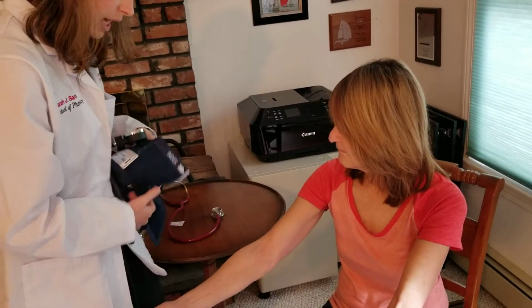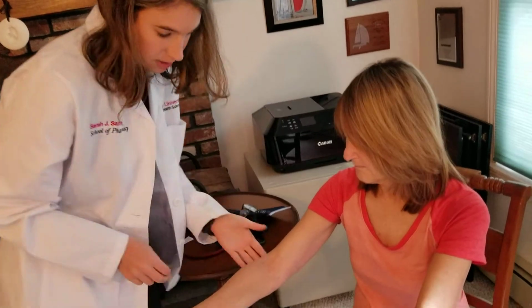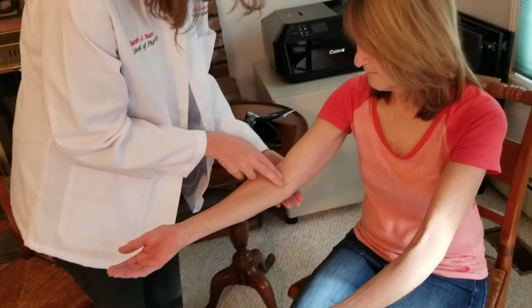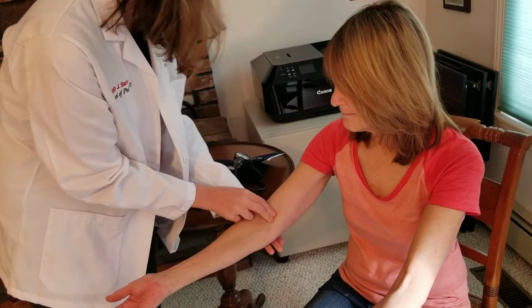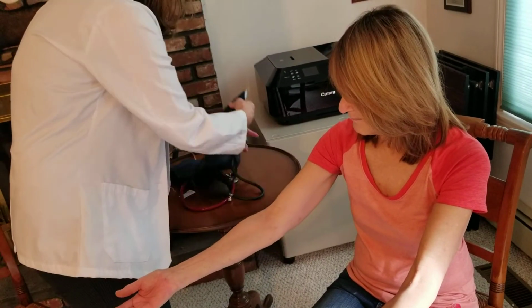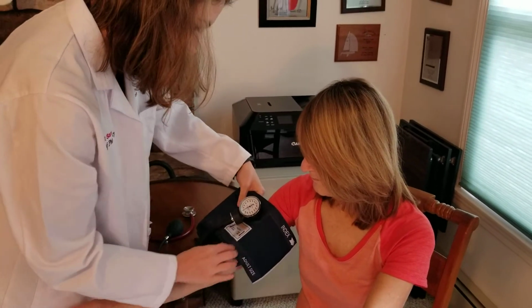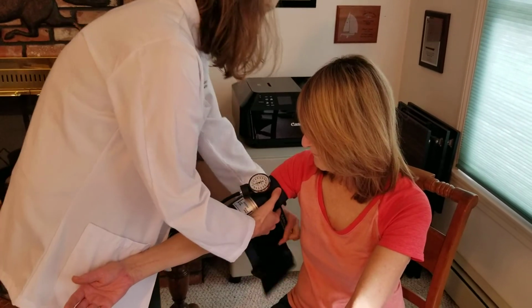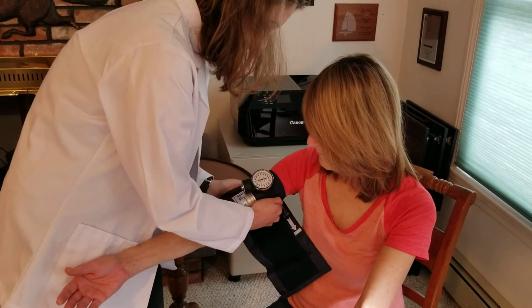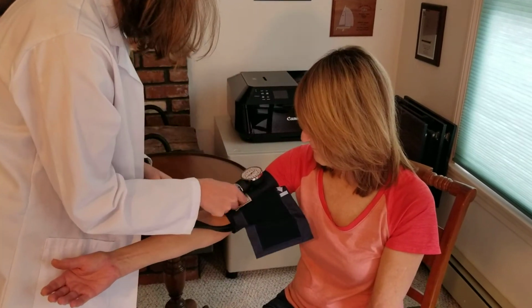So the first thing that I'm going to do here is I'm going to find your brachial pulse. So that's going to be here. Just over here. That's right there. So then I'm going to put the blood pressure cuff on your arm, lining up with the brachial pulse. I'm going to do that. I'll make sure it's tight enough there.